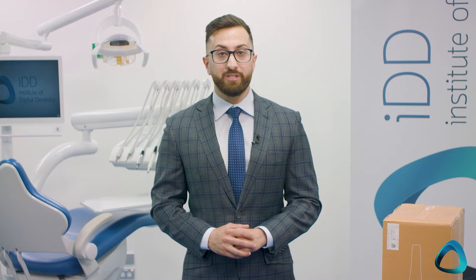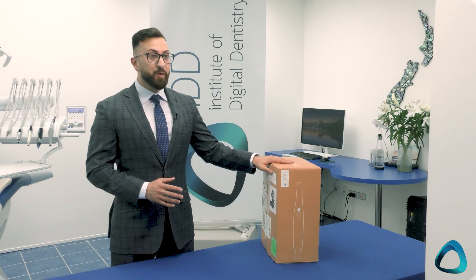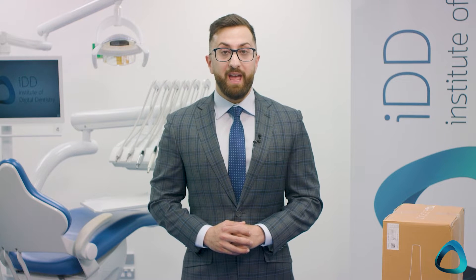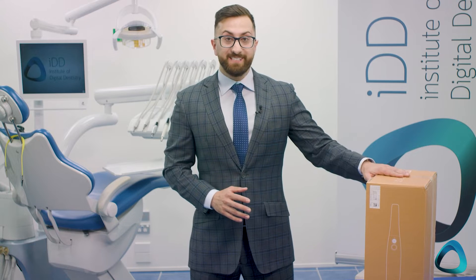We will be unboxing the i700 wireless for the first time in this video. By the time you see this video, I will have already tested the scanner extensively, and I'll also release another video about my experience with the wireless technology, as many of you will be curious about how it performs compared to the normal wired i700. As you can see on the box, this scanner comes with a battery pack and is priced at $21,900 USD — about $2,000 more than the standard i700. The question is: is it worth the extra $2,000? Let's open the box.